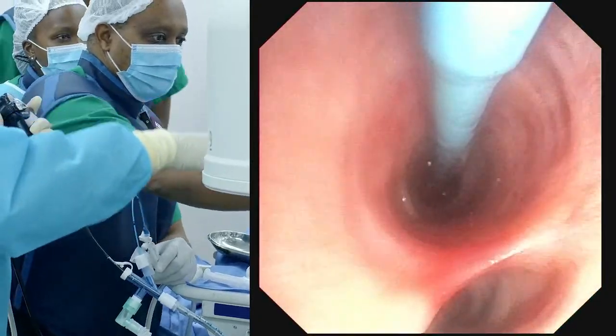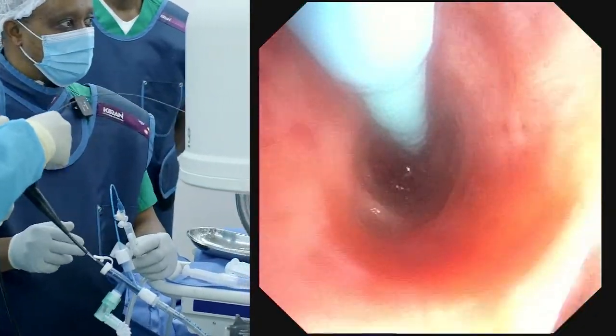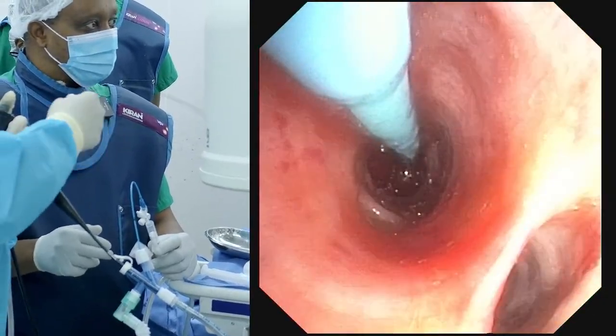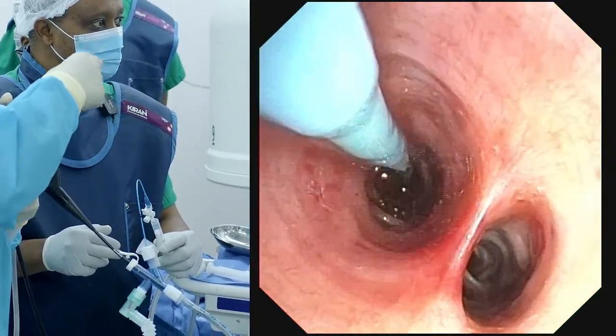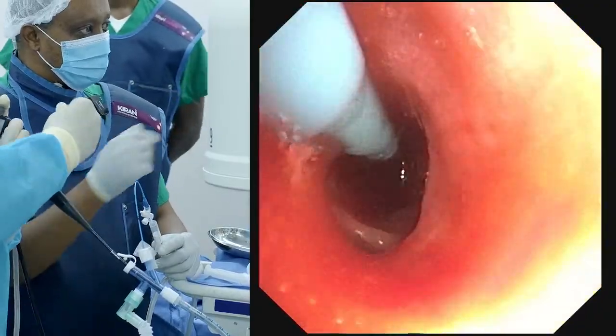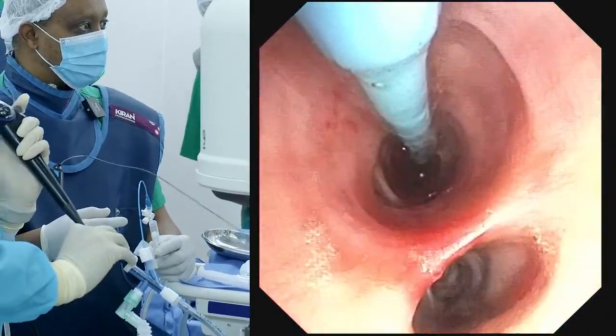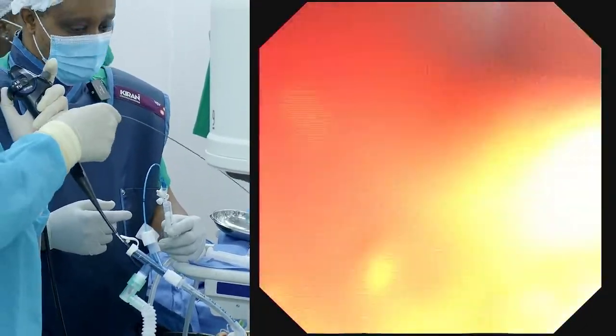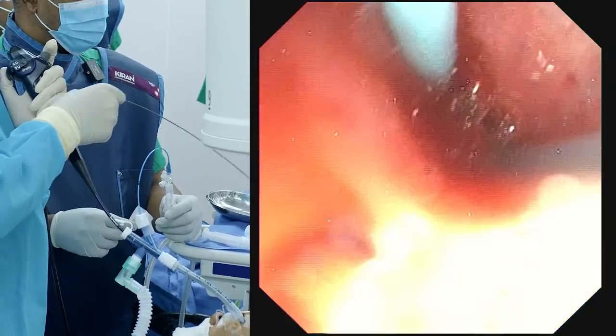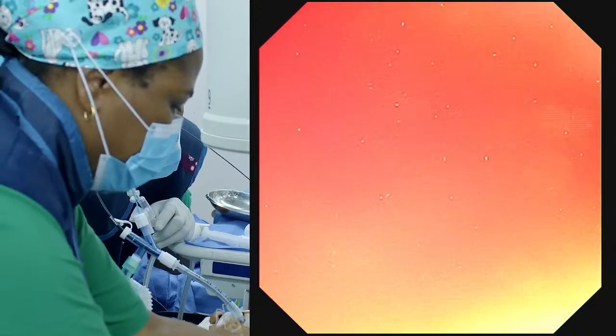So we go in again. It can break, be careful with it. You can see where it is already. That's the end. I'm going to come back out about 2 centimeters. Okay, so I'm going to freeze. Same, we can do 4. 1, 2, 3, 4.